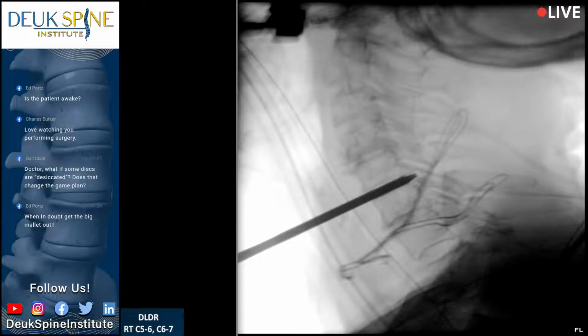Good work. It's teamwork. Makes the dream work. What do you think? Nah, I don't think so. No. Don't worry about that right now. Just step back for me. We're going to get this dilator out. You got the other one?